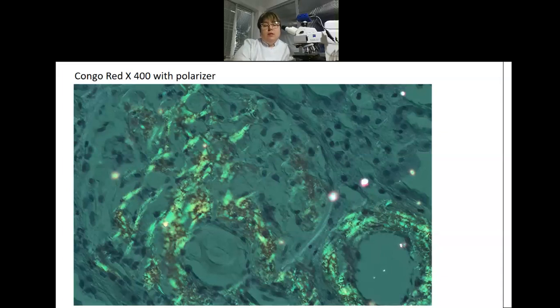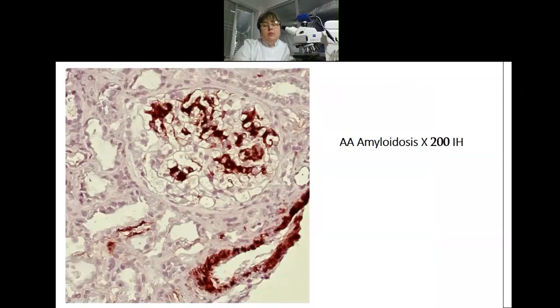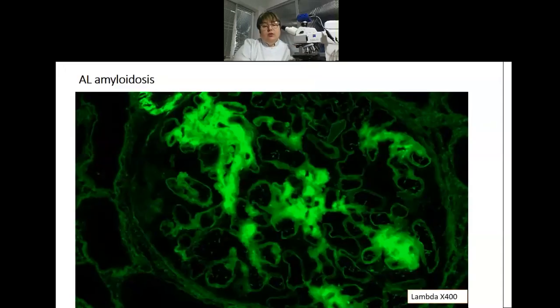This is immunohistochemical stain for amyloid — we can confirm the presence of amyloid by this stain. All pictures that we take are available for the nephropathologist as well. For this, we have a high-quality microscope and digital camera. This is another case of amyloidosis. Here you can see lambda light chain expression in mesangial areas, and the diagnosis was amyloidosis in this case.